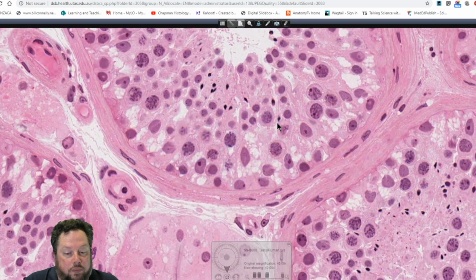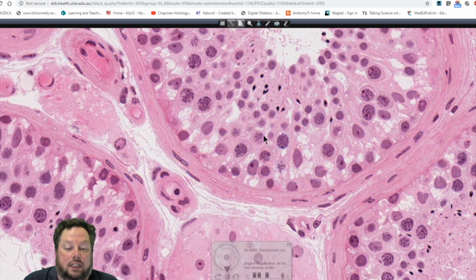So here we begin to try to identify the different cells in this section. One thing to look out for when trying to identify nurse cells or Sertoli cells is a really prominent nucleolus in a relatively large nucleus, often quite basally located. Looking at the shape, you can notice how this one here is quite pointy.